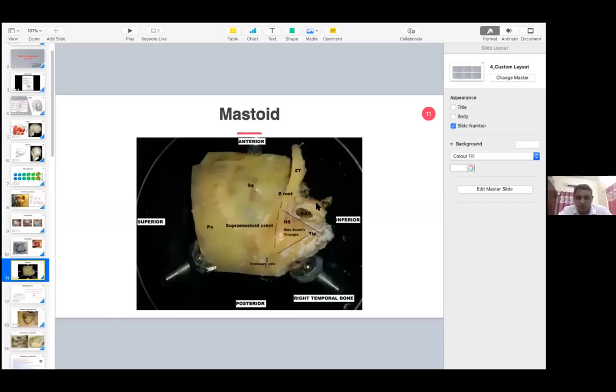So you take an endaural incision and then expose the middle ear by elevating the tympanomeatal flap. Then you expose the mastoid cortex. Don't do the mastoidectomy. You do a suprameatal well. And there is something called Triffon's perforator, which has a drill and a guard. The guard is kept in the external auditory canal. The drill is in the posterior superior portion of the external auditory canal. You drill parallel to the external auditory canal and enter the middle ear via the facial recess.